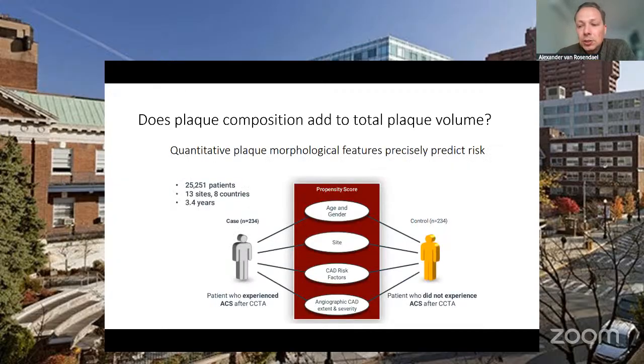Is it enough to just look at the plaque burden to risk stratify your patient? It works really well, but it adds even more to look at the composition of plaque. And that question we wanted to investigate in this study, the ICONIC study.